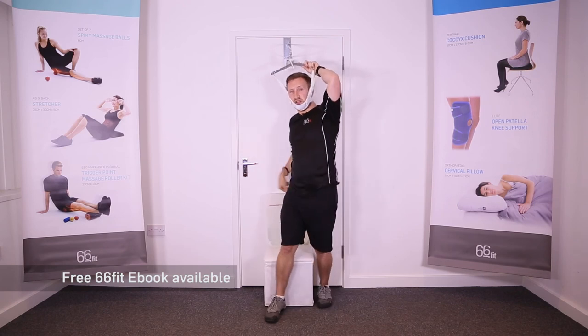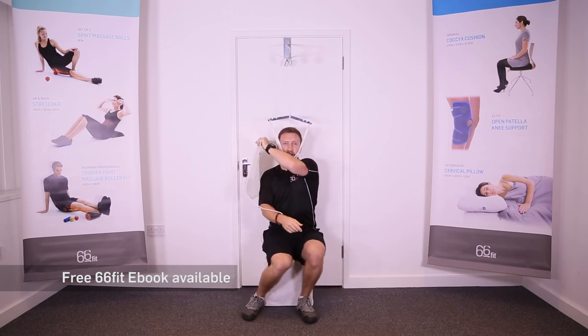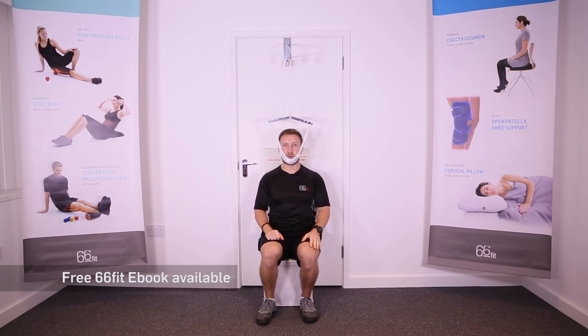Then the important bit: make sure that you take the weight of the bag before sitting down. Once you're seated comfortably, let go of the bag so it applies the traction to your neck. You'd either be facing into the door or away from the door, depending upon what your therapist prescribes for you.